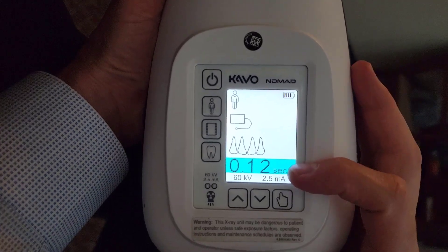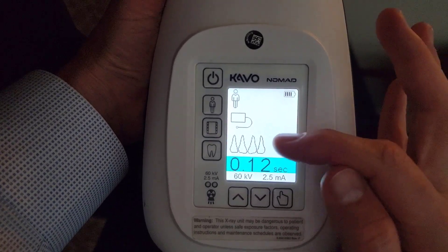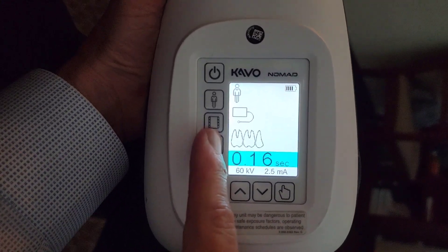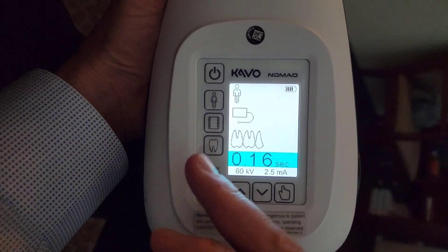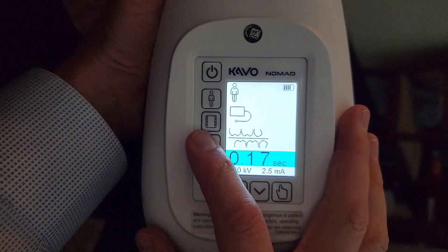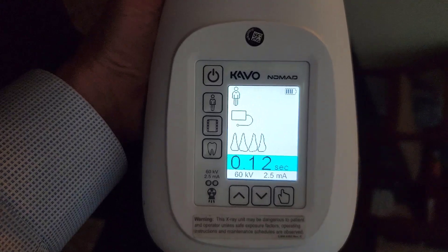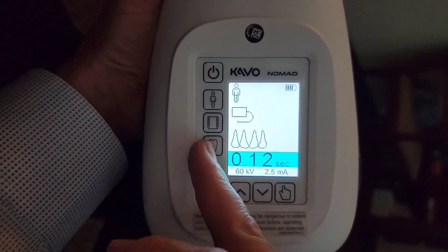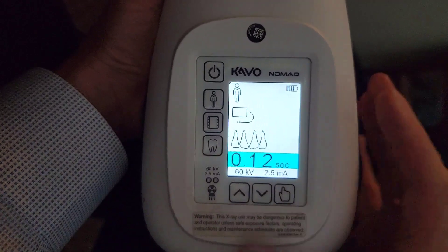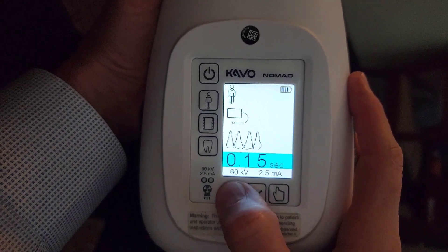So if I want to increase the time to 0.3 and save that as the default setting for your incisor periapicals — this is going to be both maxillary or mandibular — we only have three settings on the Nomad: anterior periapicals, posterior periapicals, or bitewings. So it makes it pretty simple, but you don't get a lot of different selections for different areas. Whether this is maxillary or mandibular incisor or canine, this one covers all your anterior periapicals.